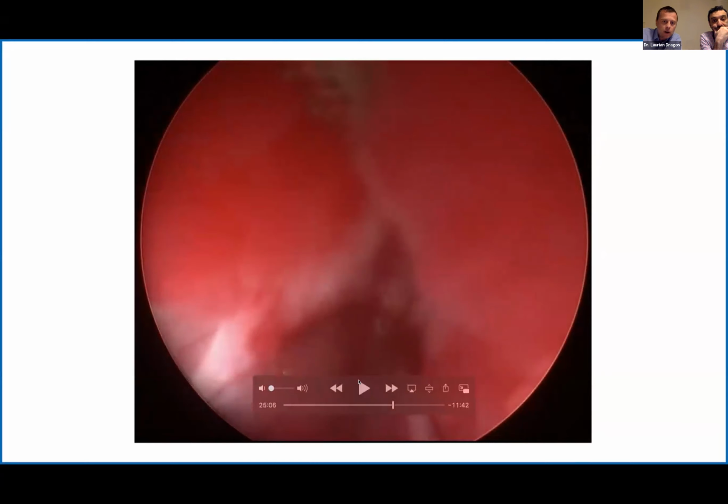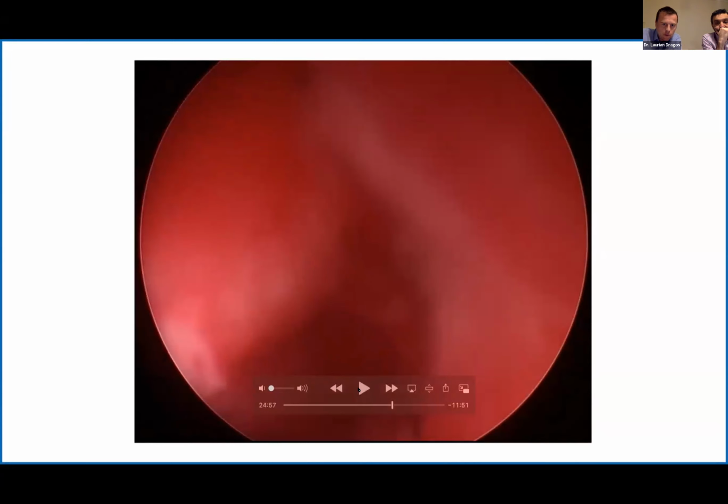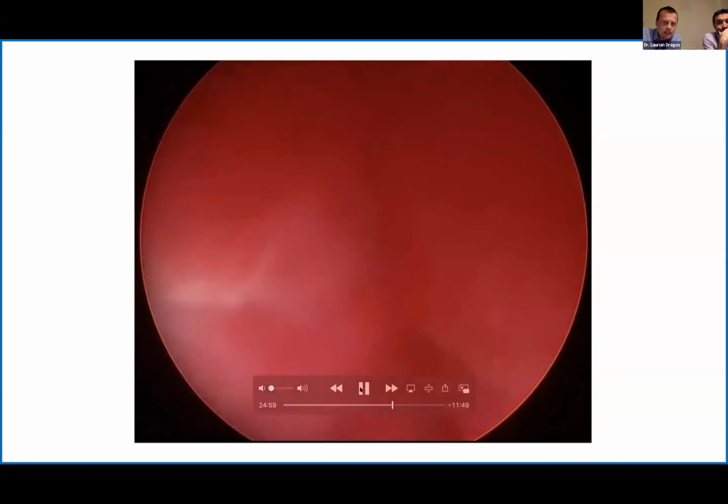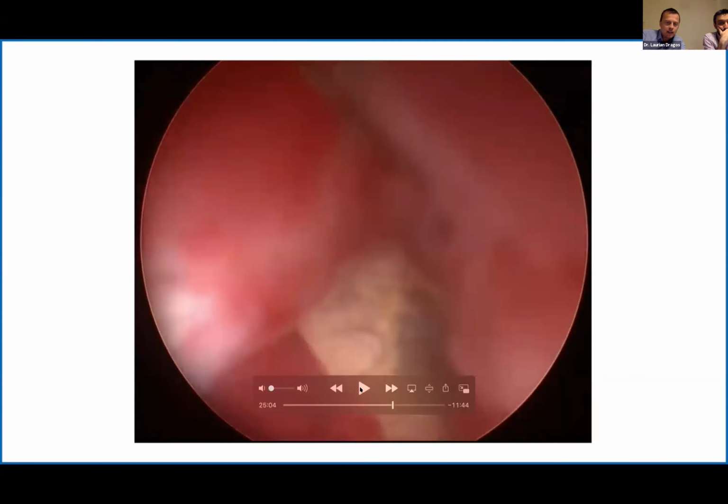Look here. So I'm going to go a bit backwards. For all of us passionate about stones, I think my colleagues have already seen that the core of the stone is of a different color. Yeah, it's much harder, and that's consistent with the stone hardness noted on the CT scan. And you see that Kasra has difficulties with this particular fragment to break completely, and the fragment goes deeper and deeper into the PUJ. My scope is back there.